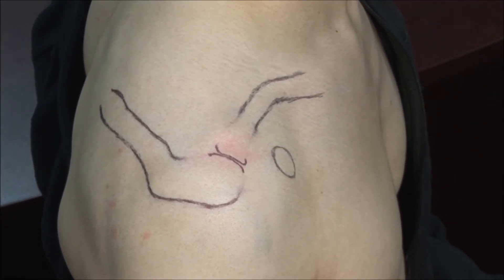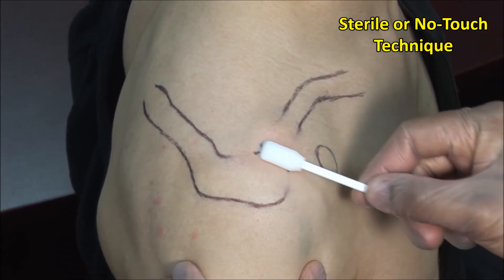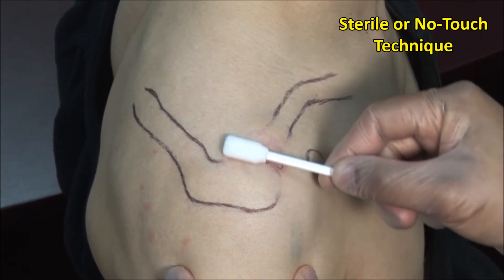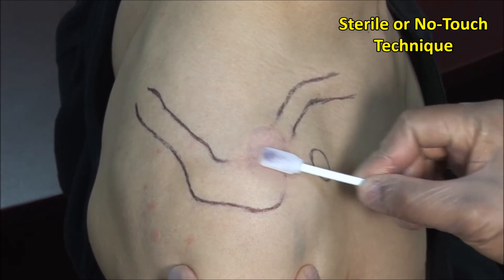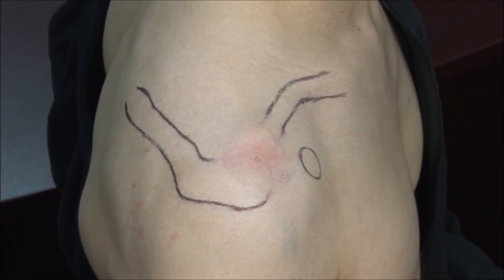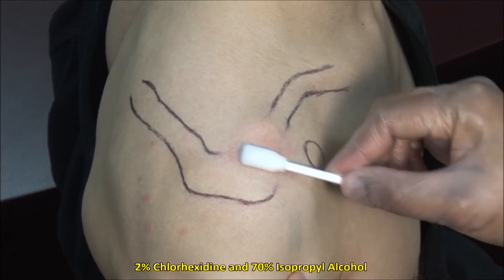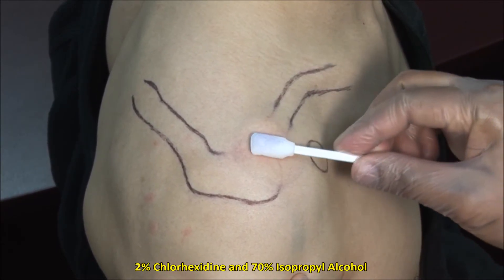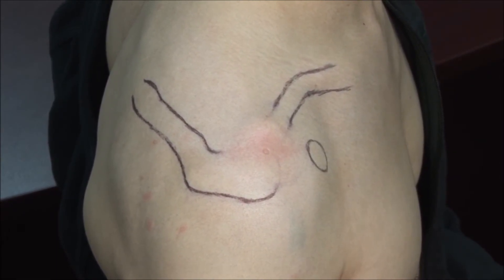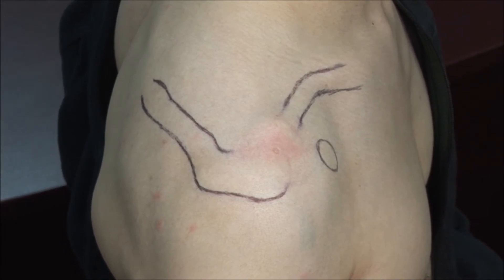These injections should always be done using sterile technique. Scrub the site and then clean in an outward fashion. Here, I am using a mixture of 2% chlorhexidine with 70% isopropyl alcohol. Alternatively, you can use povidone-iodine solution followed by alcohol.